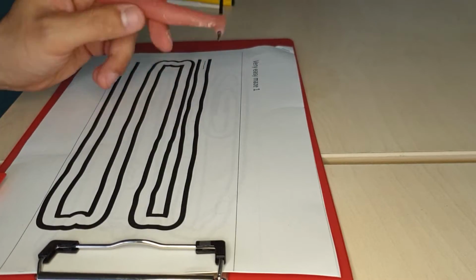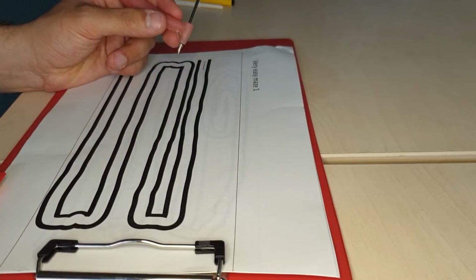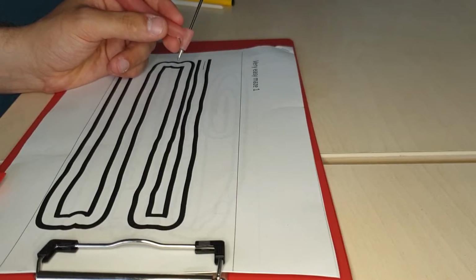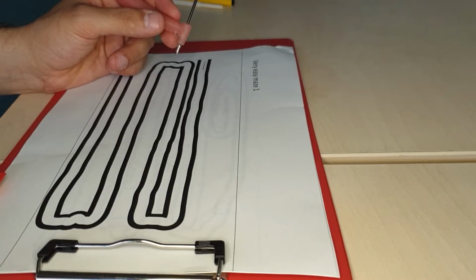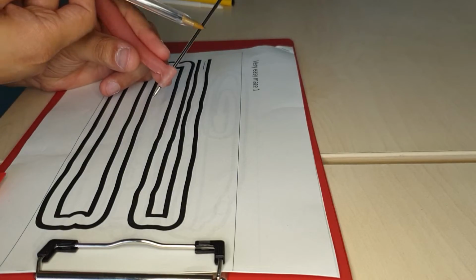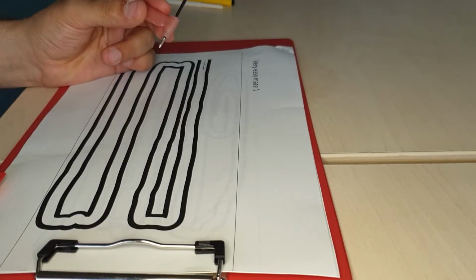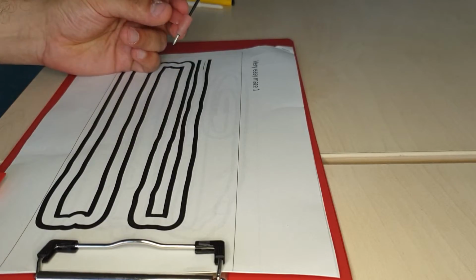This pen is fully contra-angled, just like it would be if we were using a handpiece. We very simply made these by taking an impression of an existing handpiece and then setting acrylic within the impression around the insert from a pen. You may notice on this that we have quite a long shaft of the insert left. That could be cut down, but we haven't found that that hinders the way that we position it.